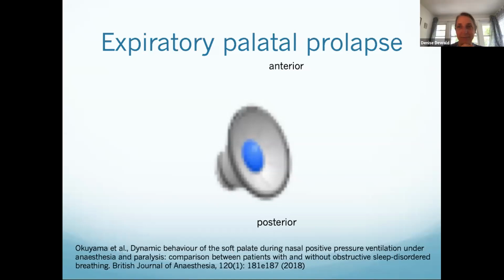All right. I'm going to simplify it next year. Well, I think we have to give it twice. You give it once and say, this is what the airway is doing. And then you've seen now 100 sleep studies, and you've looked at this. You're not going to find a lot of people interpreting studies in all three places while they think this way. So that's the problem. We're probably one of the few places that thinks this way.